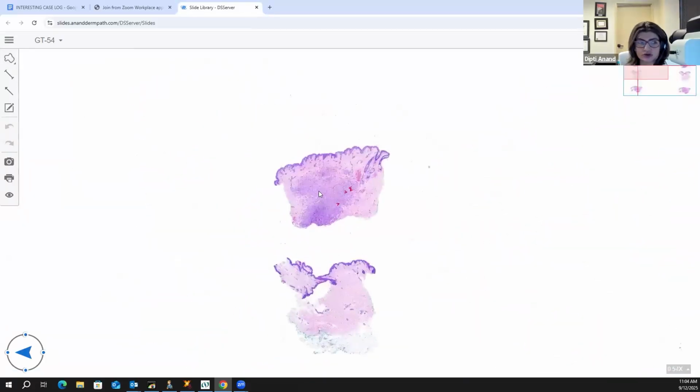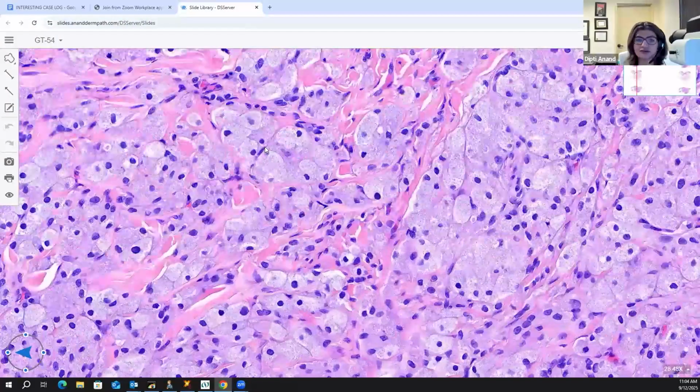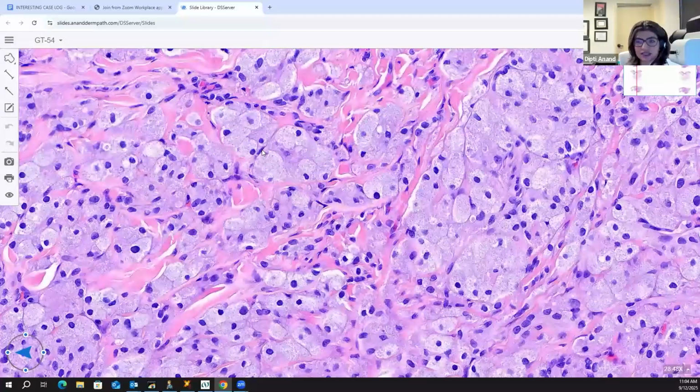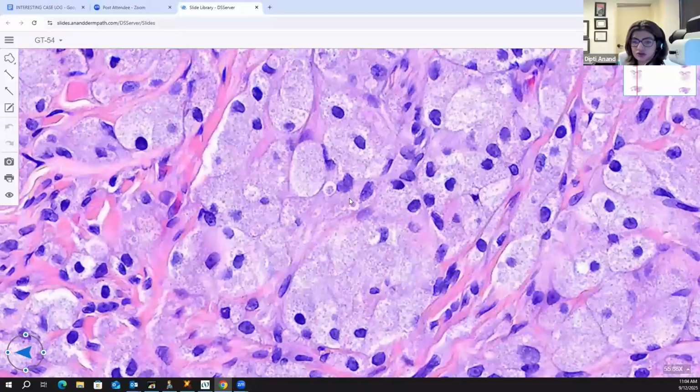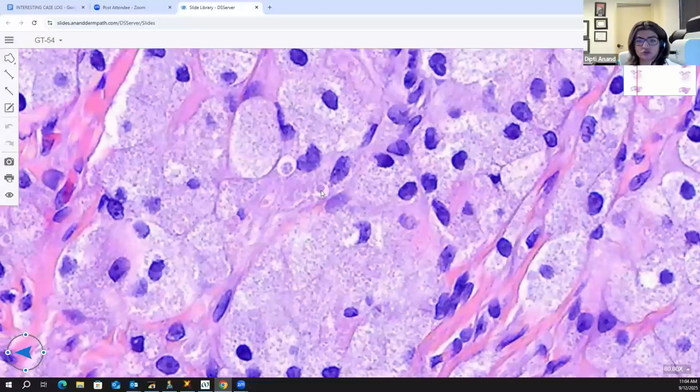The granular cell tumor is Schwannian in origin. It consists of packets and nests of cells which will have eosinophilic granular cytoplasm. So you can see why it can mimic a granulomatous tumor, because of the pink cytoplasm and the big cells. The individual granules are pretty prominent, and the classic feature you're looking for is the pustulo-ovoid bodies of Milian.